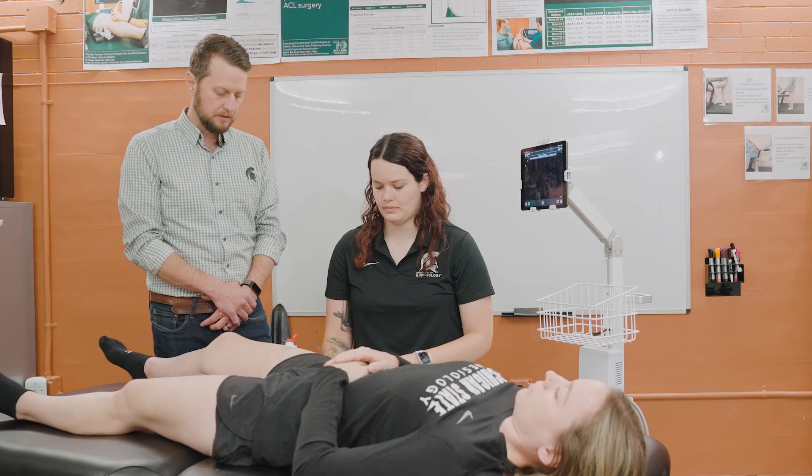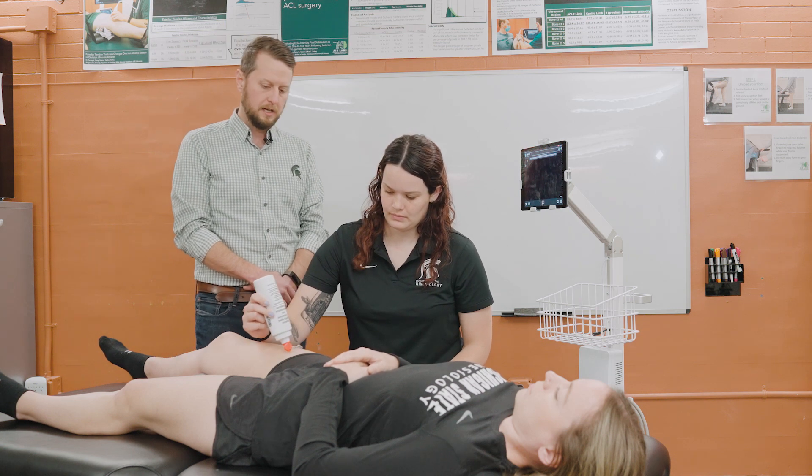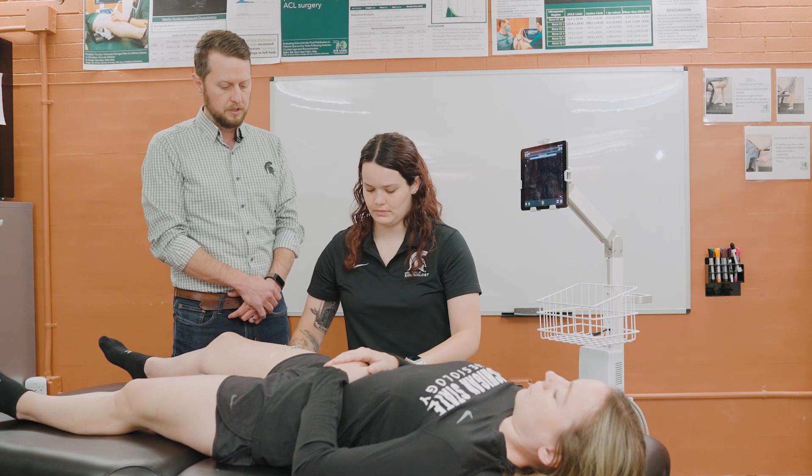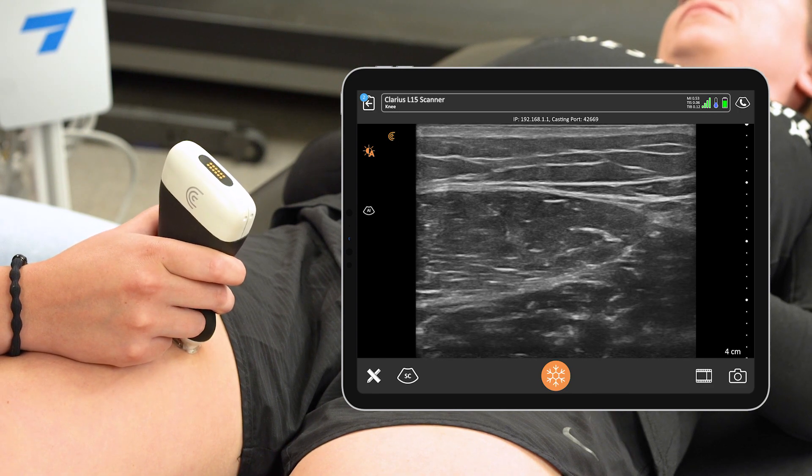Once we do this, we'll put our ultrasound gel on that position and then put our Clarius probe on that muscle to gather the image that we're planning to take.